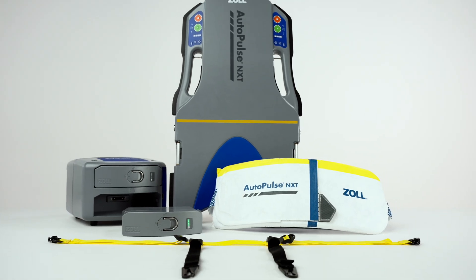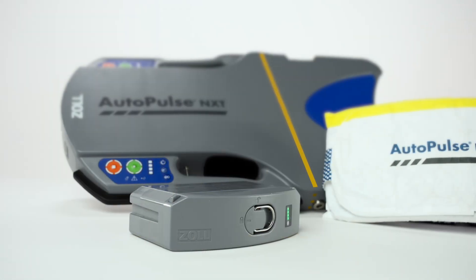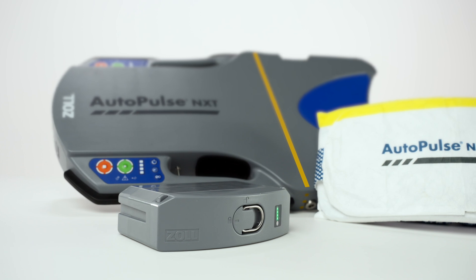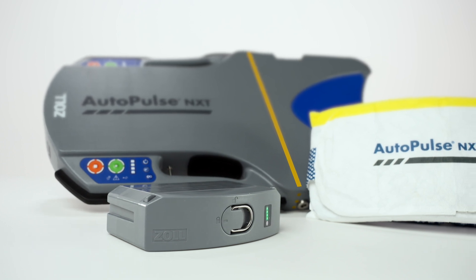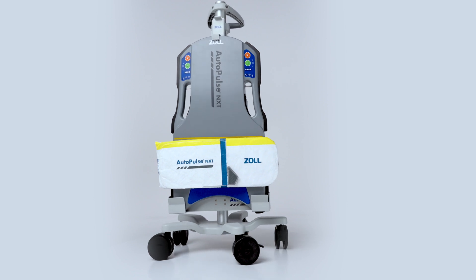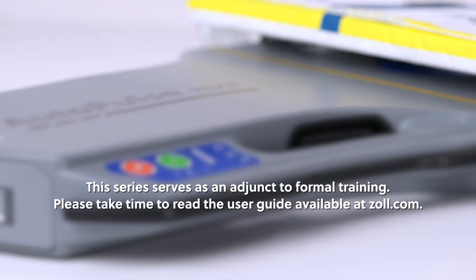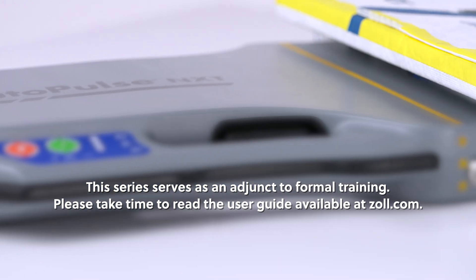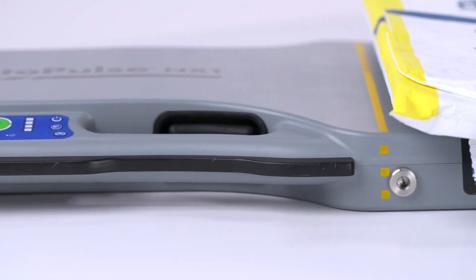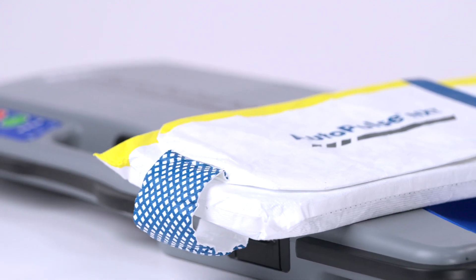Welcome to the AutoPulse NXT Resuscitation System in-service video series. This multi-part series provides detailed information about the AutoPulse NXT Mechanical CPR device and its functionality. This series serves as an adjunct to formal training. Please take time to read the user guide available at zoll.com. Proper use of the system requires a thorough understanding of the product, appropriate training, and practice.